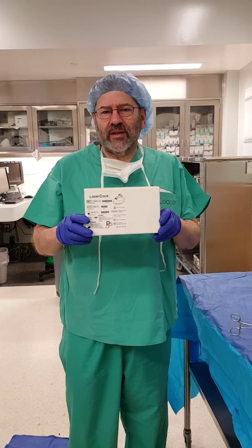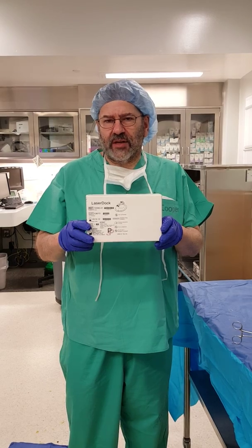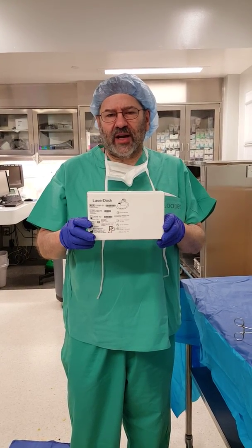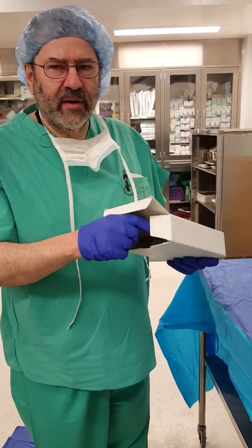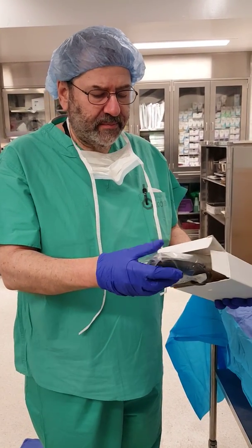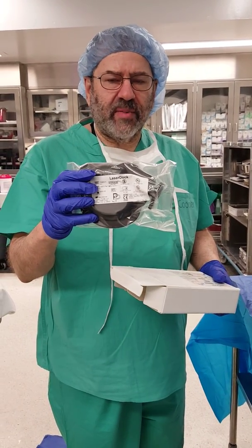Ceftel here demonstrating the use of the laser dock laser fiber safety holder for surgical cases wherein a laser fiber is used. The laser fiber will be on the surgical field, and the laser dock will be taken out of the box. As you can see, it comes in its own sterile pouch.